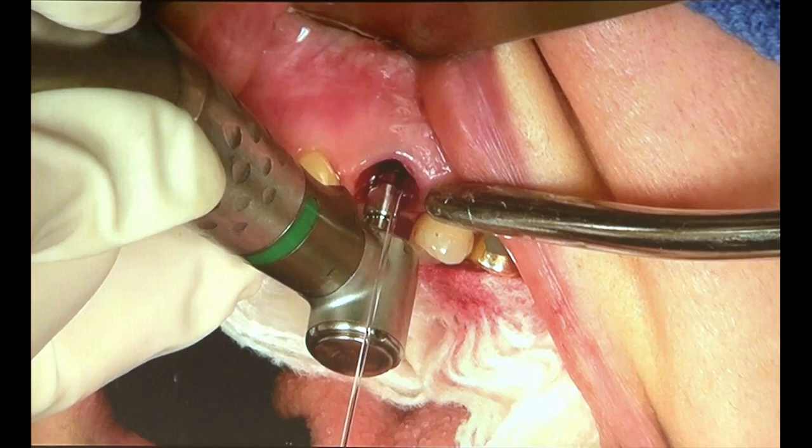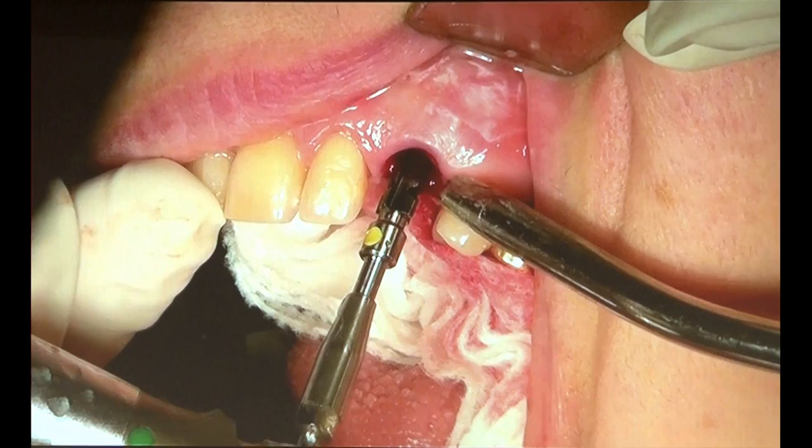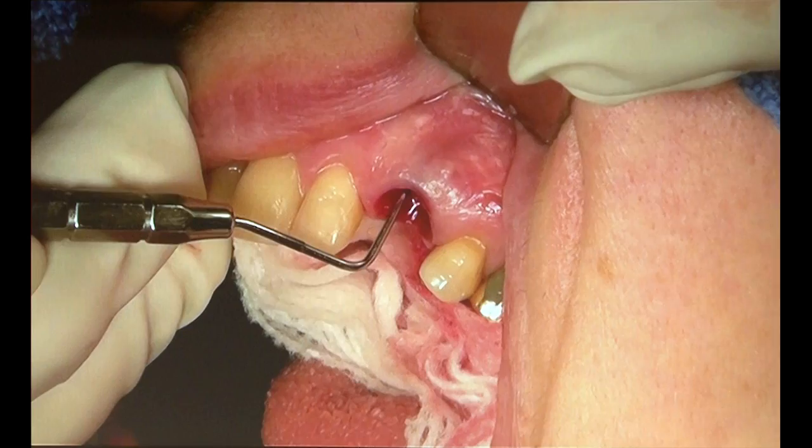And as you can see, we're preparing it with a tapered twist drill, and then further preparing the site now with the drill extension because the handpiece was hitting the adjacent tooth. Now, when I remove the handpiece and you see that twist drill stays in the site, you know you'll be able to establish appropriate and proper initial stability.